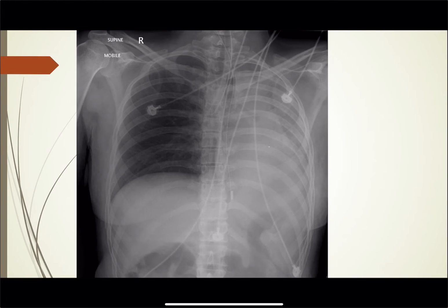This one is not so normal. We're looking for ET tube placement. You can see this patient has an endotracheal tube. The carina is a little more difficult to pick out — looks like it's going to be right about there. I'll show you a way to tell by counting ribs and thoracic vertebrae. The carina usually sits about T5, T6, or T6-7.